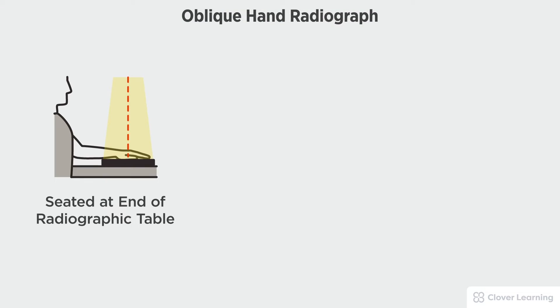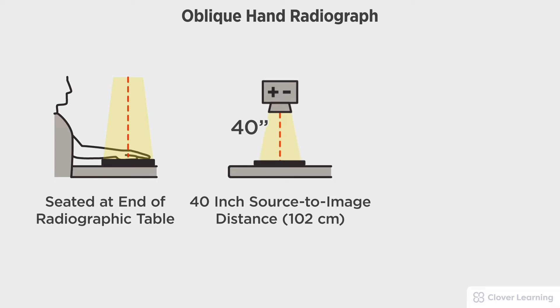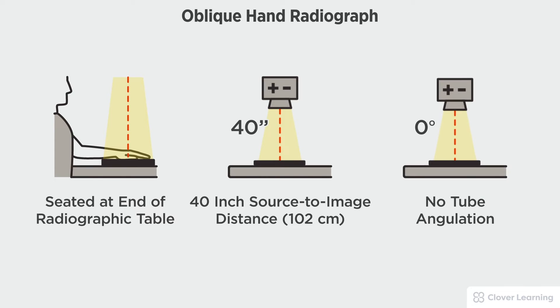In this view we will be demonstrating the oblique hand. The oblique hand should be performed with the patient seated at the end of the radiographic table with the image receptor placed tabletop with a 40 inch source to image distance and no tube angulation.